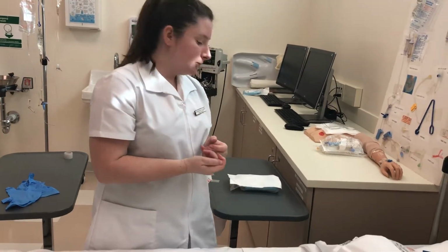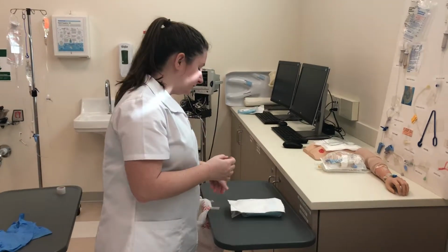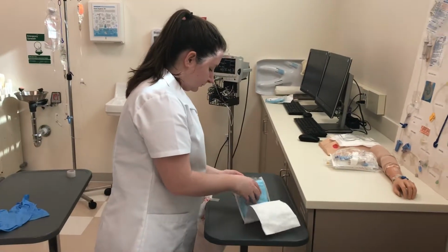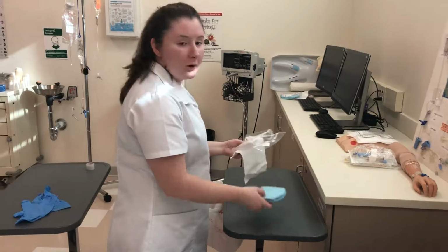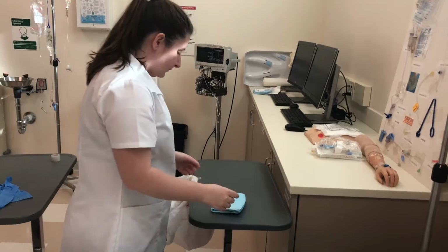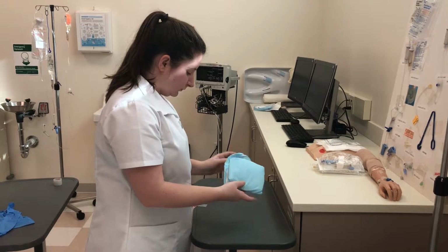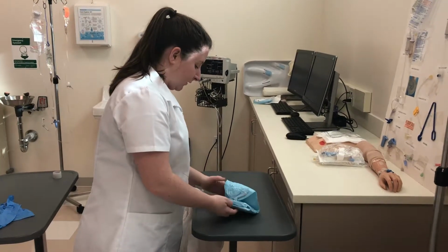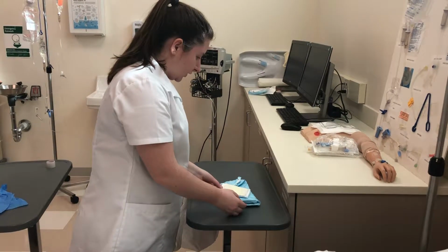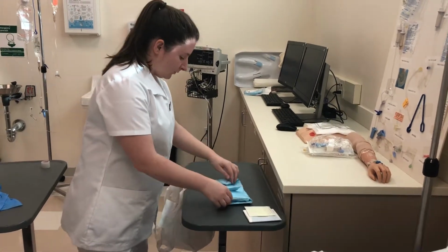So the next thing I'm going to do is open my central line kit. And I have my garbage bag over here on the side of the bed. And when I open this up, I have to be mindful that I am not touching anything inside the sterile area.